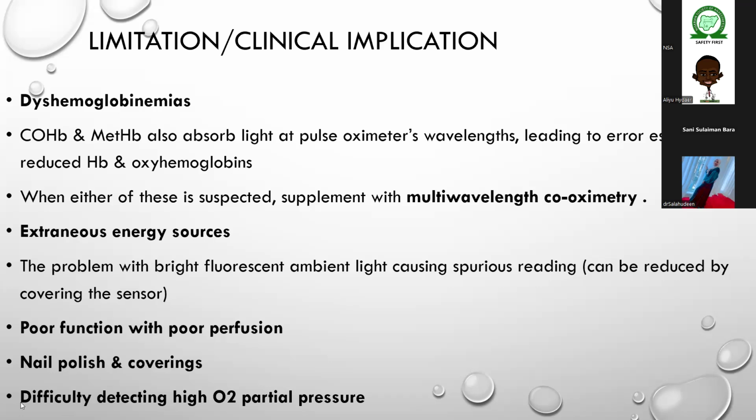Then there is nail polish and covering, and difficulty detecting high oxygen partial pressure. Because SpO2 will just be giving us 100%, even when the patient is getting to a toxic level.